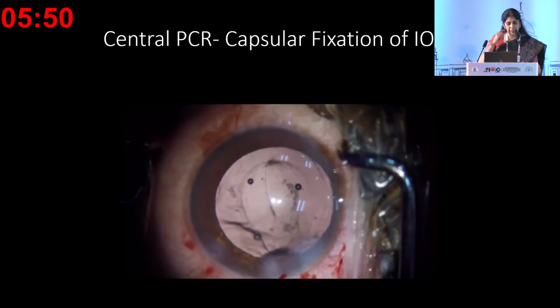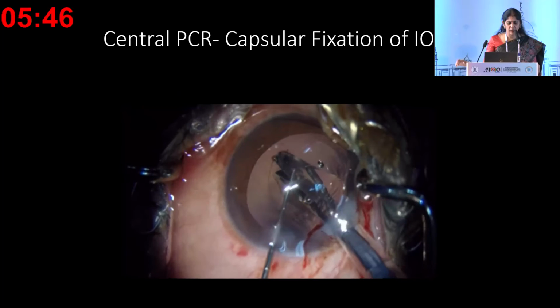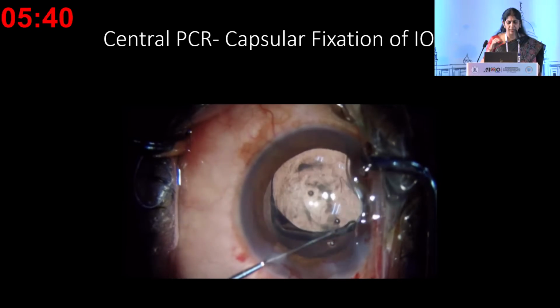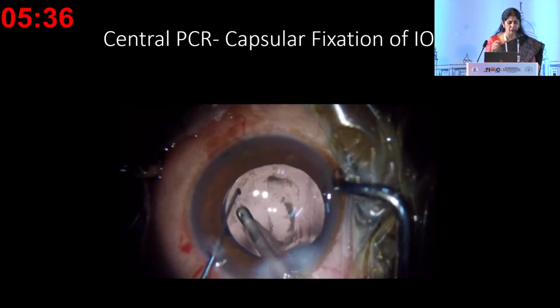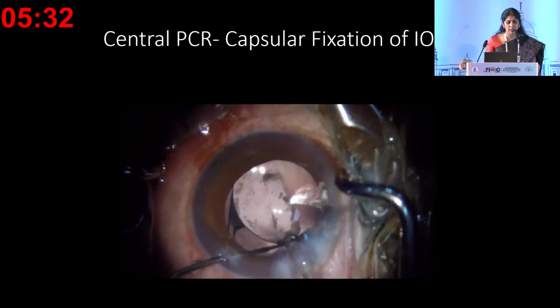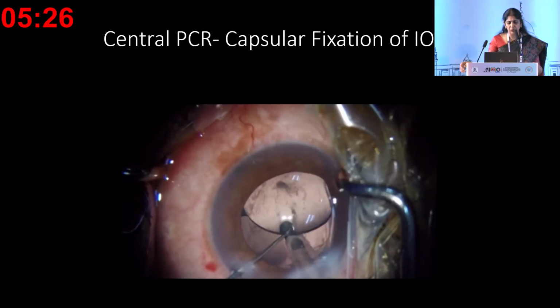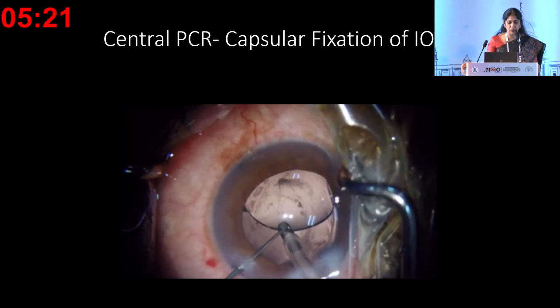This will help to contain the vitreous loss and prevent the PCR from extending larger. So you can see a central split in the PC because of the posterior capsular rent. IOL in the bag, single piece, ensure the leading haptic and optic junction is flexed so that it can actually go into the bag without having to dial it. So it's not a good idea to dial these lenses into the bag, but you can just flex the haptic. That's why single piece lenses are preferable when you're trying to place an IOL in the bag. You don't have to go and remove the viscoelastic behind the IOL in most instances.